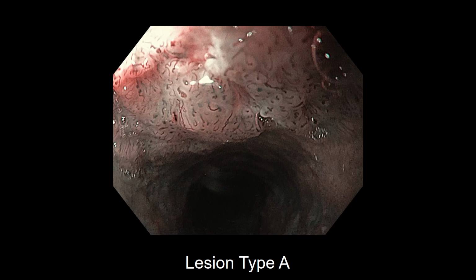This is a little bit more distal. When I see this, I would also say it grows somehow into the lumen. And we also see IPCL. The diameter is not that enlarged, but it looks a little bit more than normal. So I would suggest maybe also still mucosal, or what do you think?